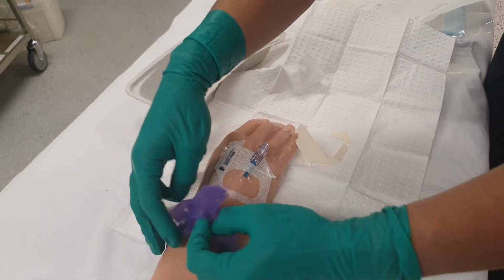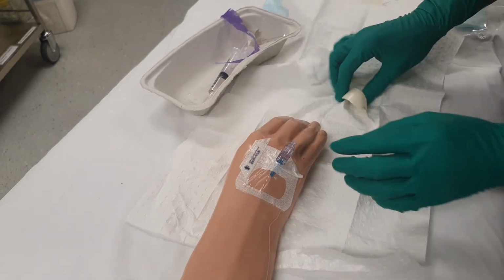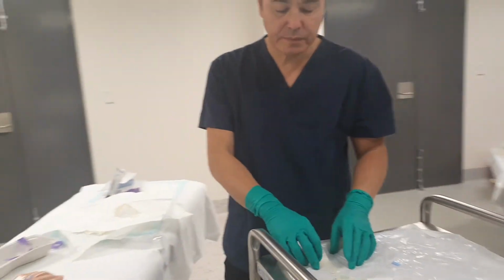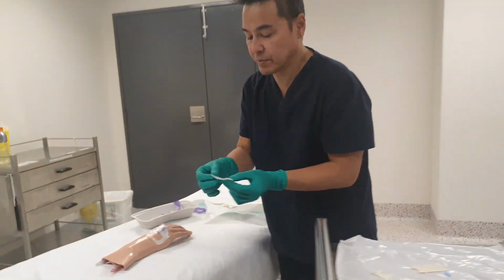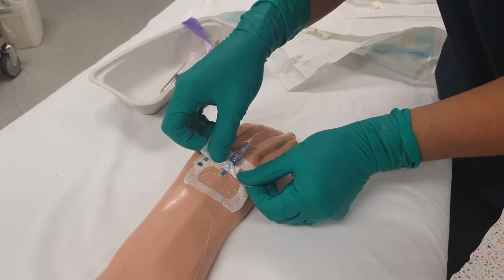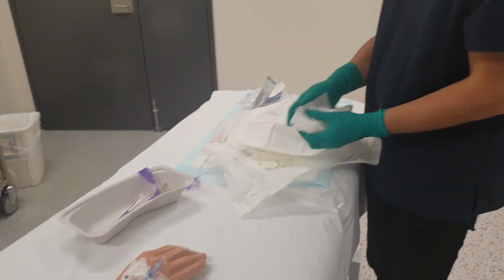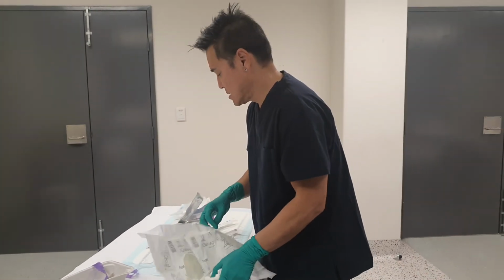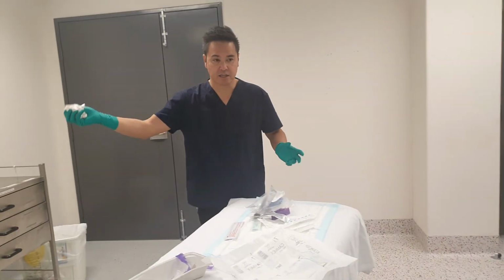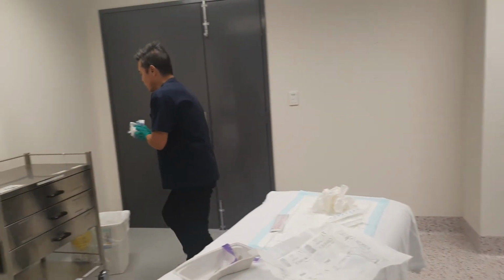Okay, tourniquet comes off. Thank the patient. Clean up your mess. All right. I guess we can put this Steri Strip on. This Steri Strip goes underneath and seals that for you. Okay, so this is contaminated waste. This is the only contaminated waste. So I'll put this in the yellow contaminated waste bin. All this paper, put it in the normal bin.